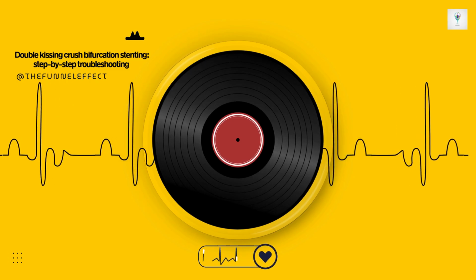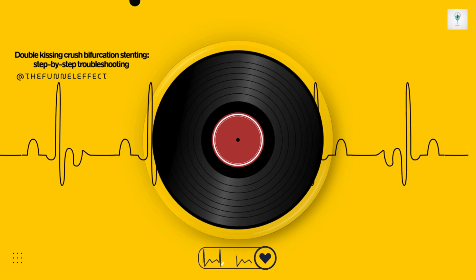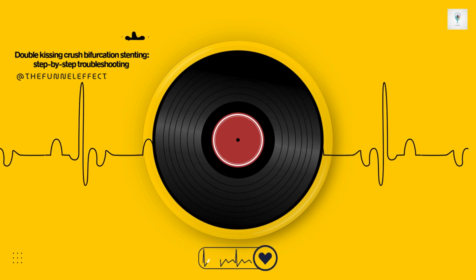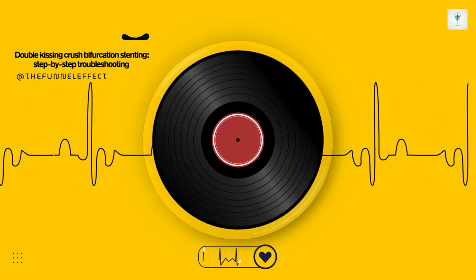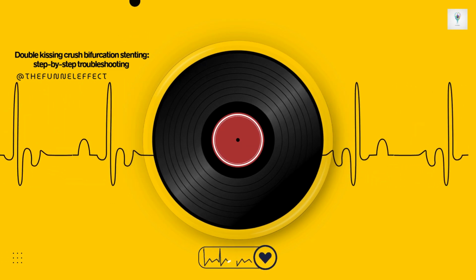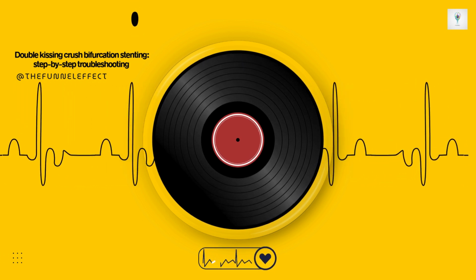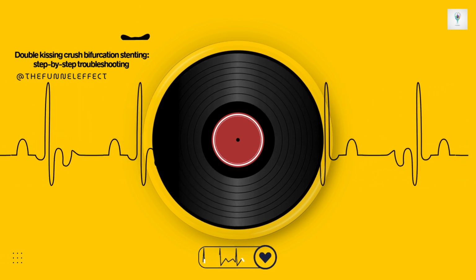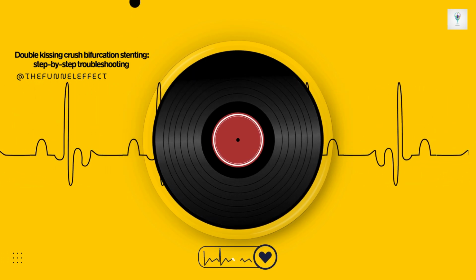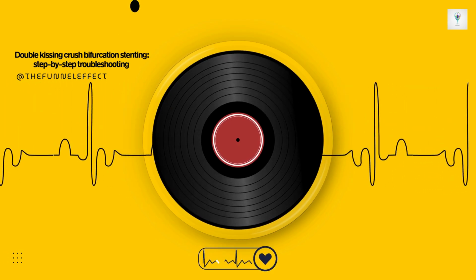Now, step 5. Rewiring the side branch through that crushed stent layer. This sounds technically demanding. It is. And this is where DK crush really differs from, say, classic crush and why it's generally superior. The rule here is you must aim to recross through a proximal stent strut. You want your wire to enter the SB closer to the main vessel origin, not further down through a distal strut opening. Why? Recrossing distally tends to badly deform the crushed SB stent and can leave a significant gap near the carina, that neocarina issue we mentioned. Proximal recrossing minimizes deformation and sets you up for better coverage during the next step.